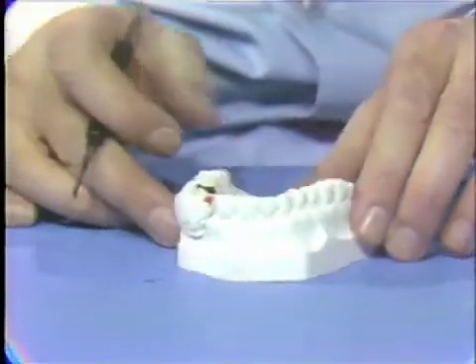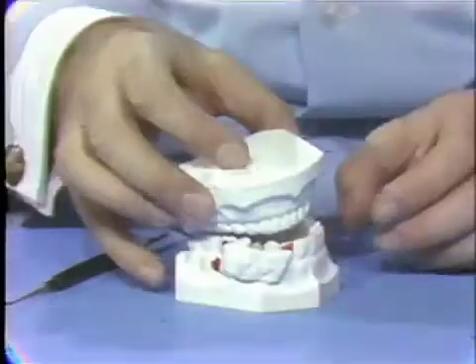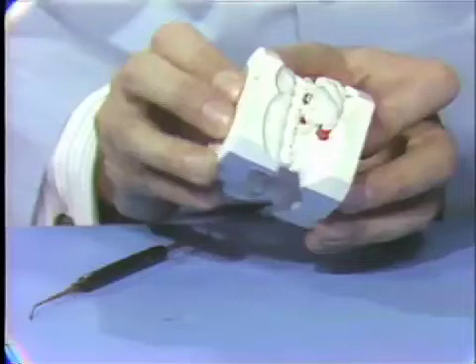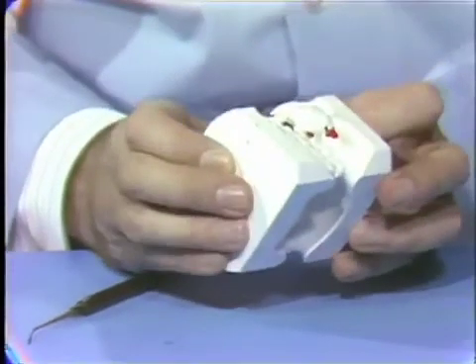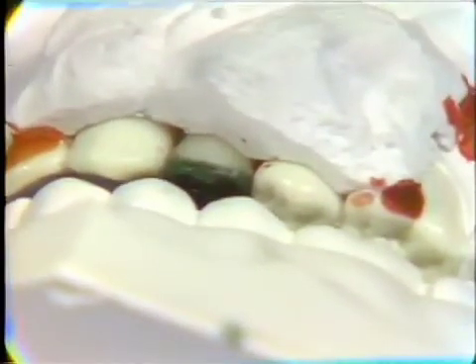And if I turn this around, you can see on the labial surface here the occlusal protection of gold just going over the labial surface there. We have, of course, taken the opposing model and held it in position and checked the relationship as we did before in developing space down between the teeth on the labial there. And in a clinical case, of course, where it was mounted on an articulator, you would check this too in lateral excursions, which we cannot do in this particular situation.